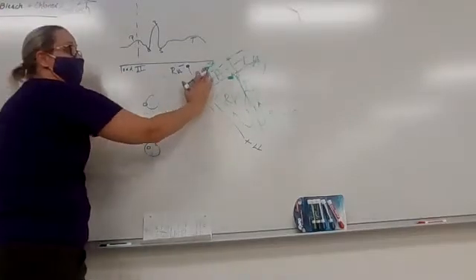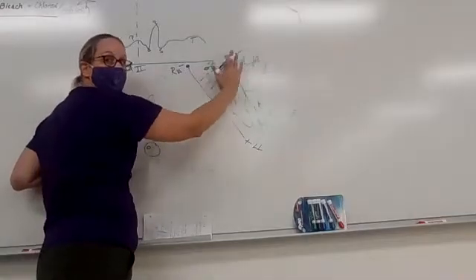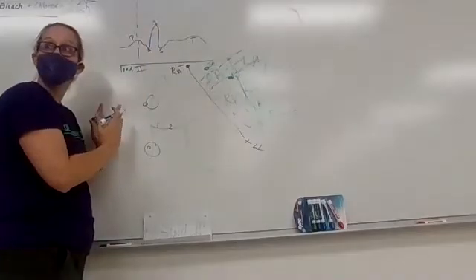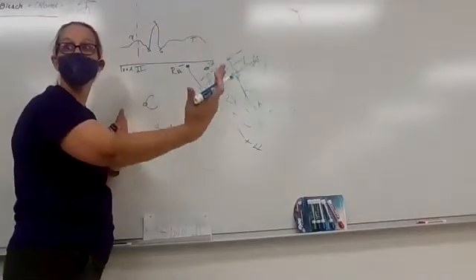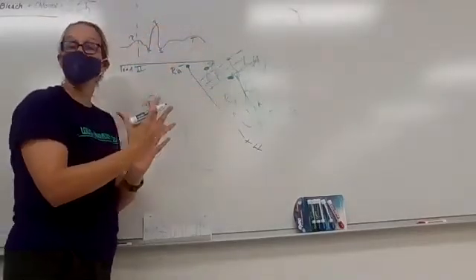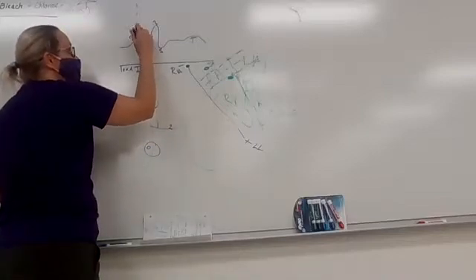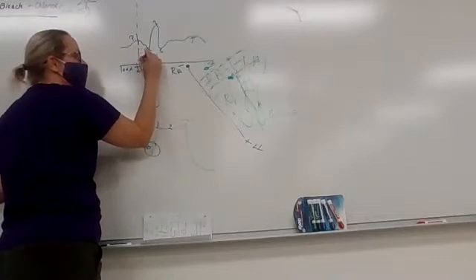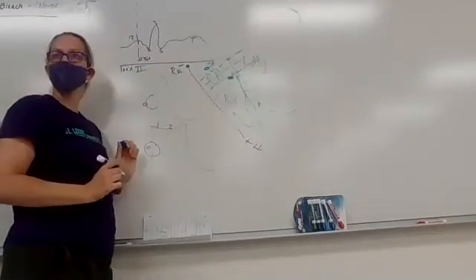And collectively, we're capturing all that depolarization here. And then, following electrical events, we should start to see those physical events. And so right around this point in the middle of the P wave, if we were doing a cardiac cycle, that would probably be when the atria starts into systole.